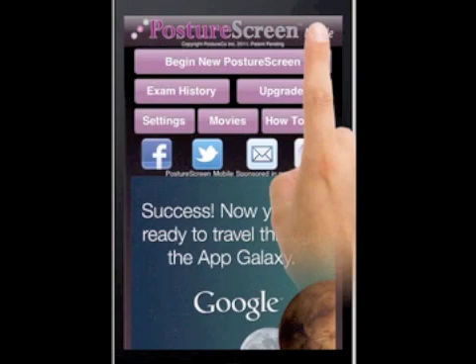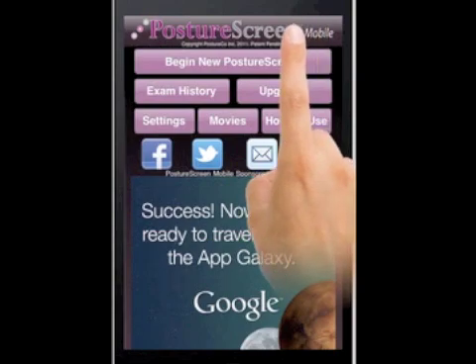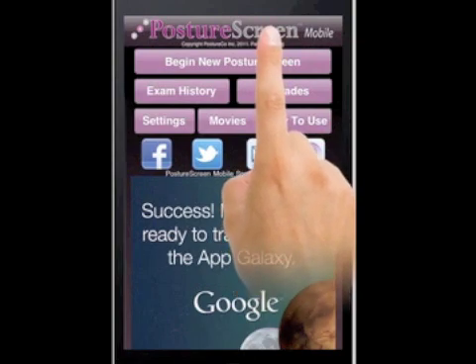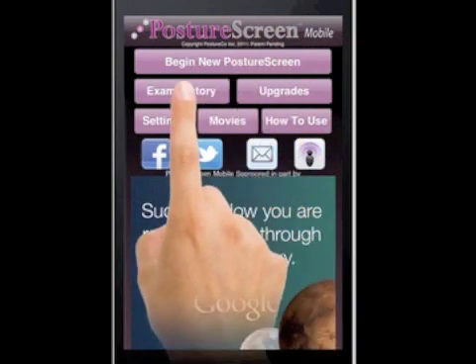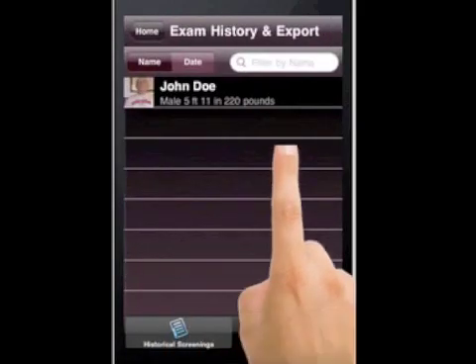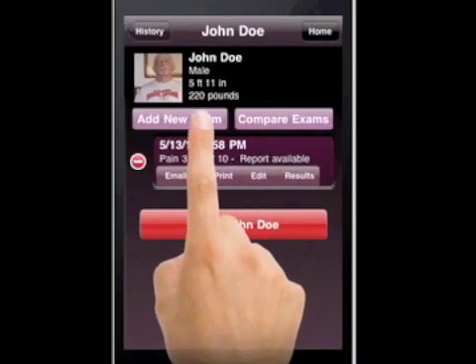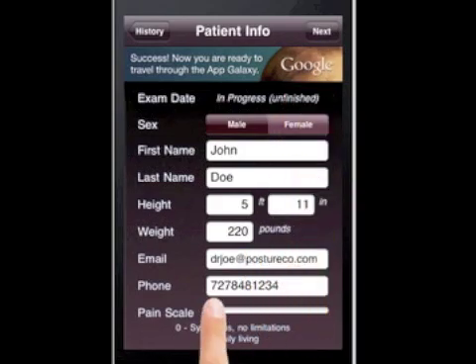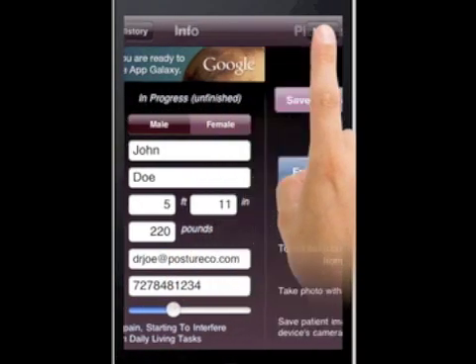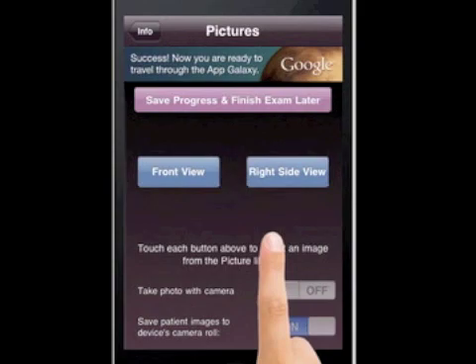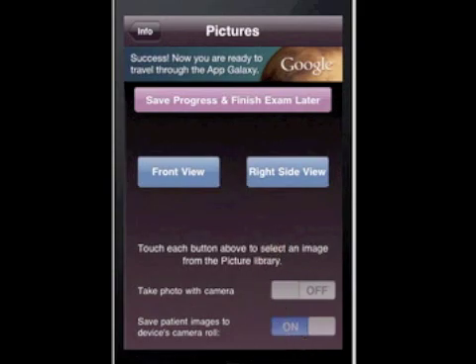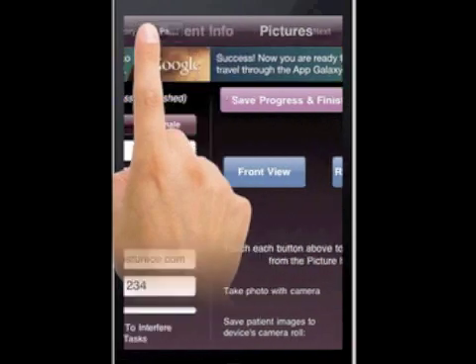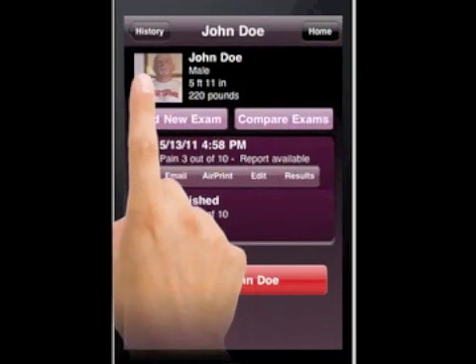If we had another patient coming in and we're going to do a comparative exam, I'll show that in a separate video. It's easy — just come in here and hit Exam History. If they're already in there, hit Add New Exam, change their pain scale, hit Next, and then go ahead and digitize a second time. That concludes how to perform your first postural screening with Posture Screen Mobile.